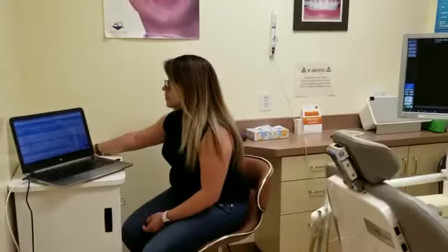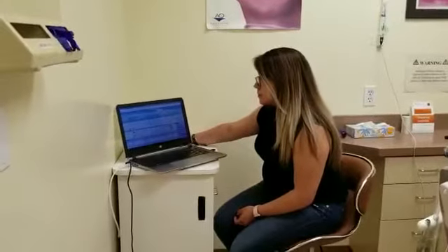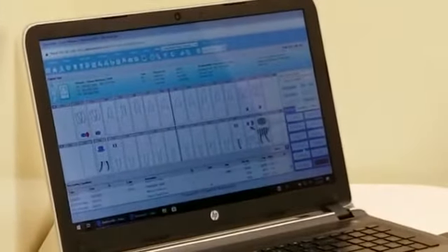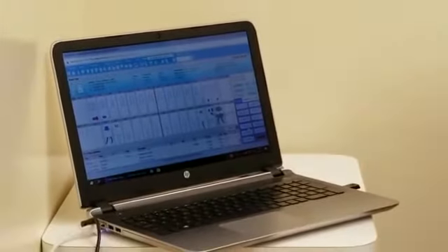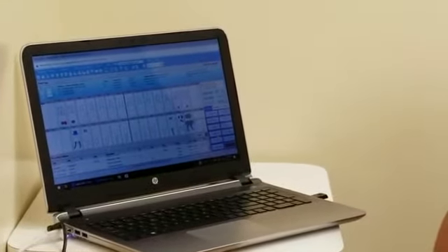So Amy, on tooth number 2, please indicate there's decay on the mesial. Amy's not going to go to the progress notes. She's going to take all of the pre-existing and any problems that I find on the x-rays, or any problems that I find while I'm doing the exam. All pre-existing defects or problems are going to be charted.